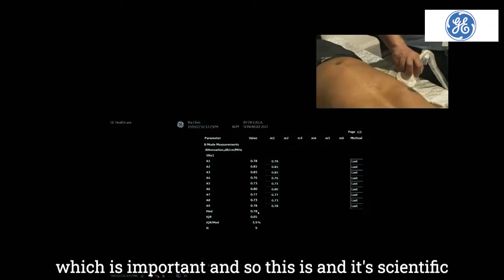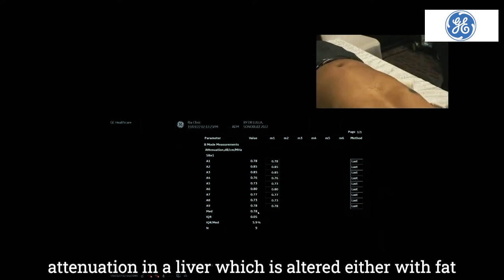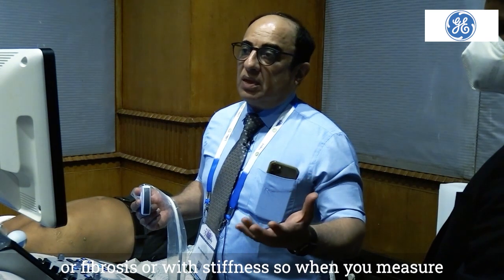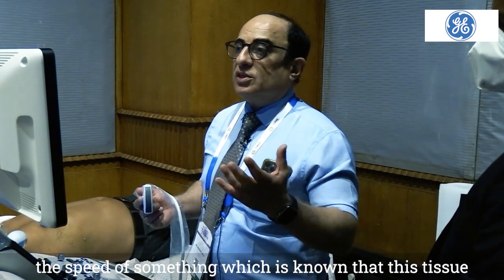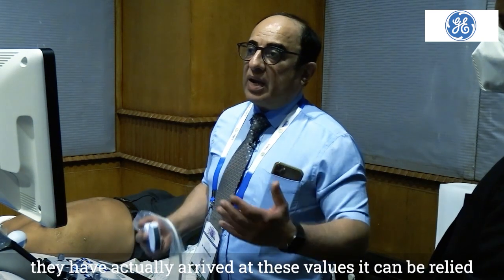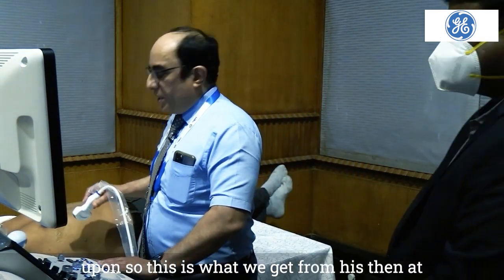And it's scientific because you're actually measuring the speed of attenuation in a liver which is altered either with fat or fibrosis or with stiffness. So when you measure the speed of something which is known, that this tissue is behaving accordingly with known phantoms, they have actually arrived at these values, it can be relied upon. So this is what we get from him then.